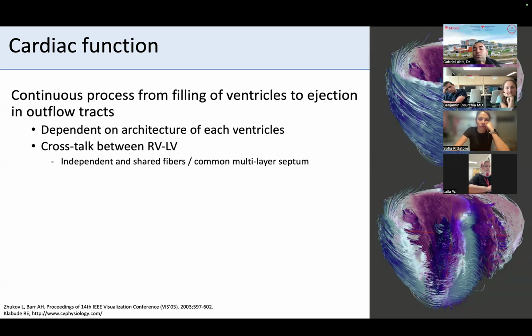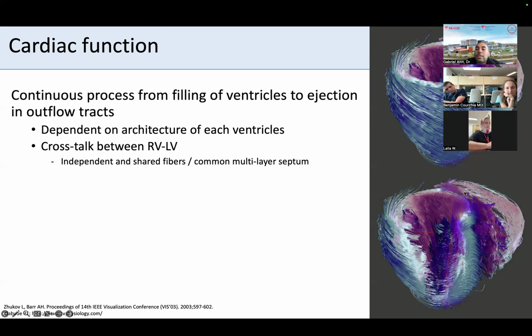Because of that, you will underfill your left ventricle because the LV preload is dependent on the pulmonary blood flow. And number two, this RV that can become very pressure overloaded can start impinging onto the LV. And so the septal configuration might start to block the LV filling because it becomes so overloaded that your LV can become pancaked.